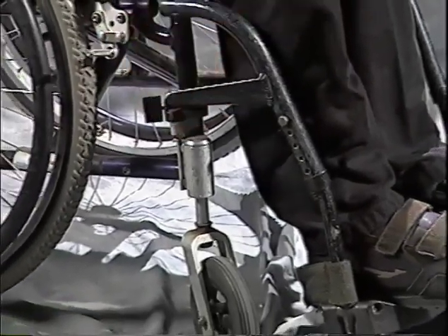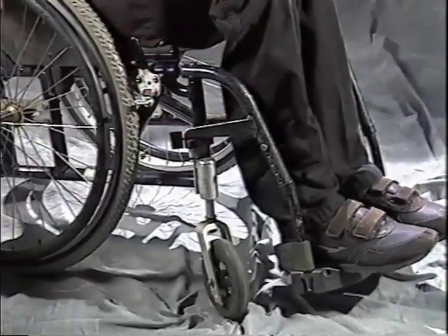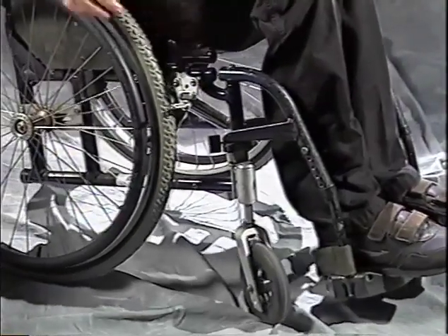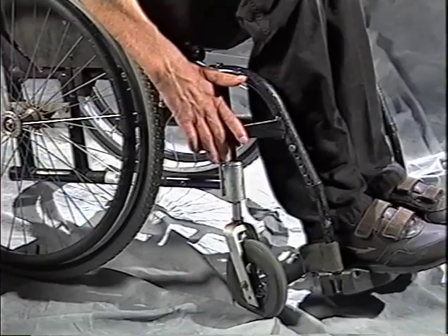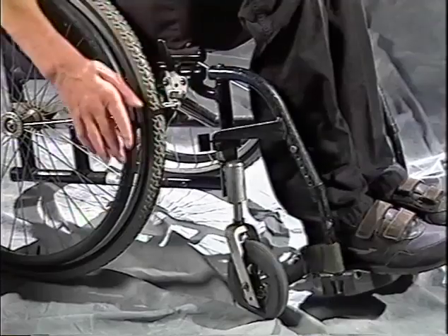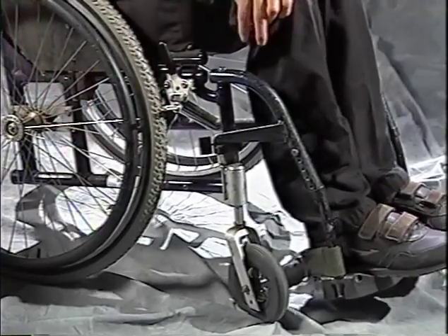You want the caster to be straight up and down so that it's not trying to sway the chair one way or the other when you're moving it forward or backwards. So you really need to try to get this spindle of the caster fork to be 90 degrees to the floor.